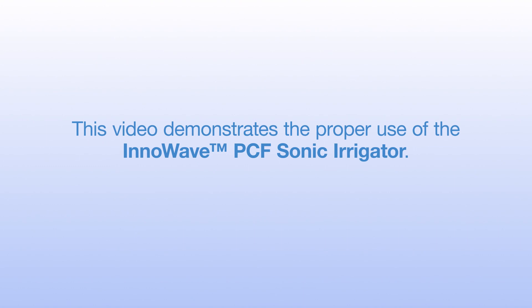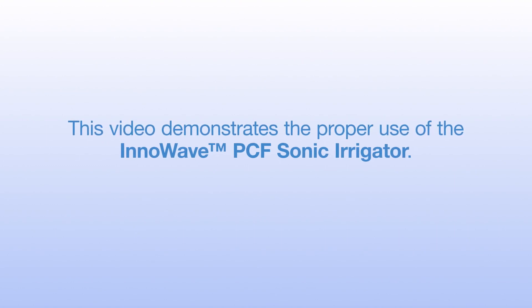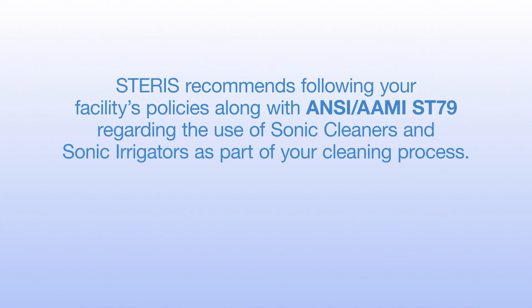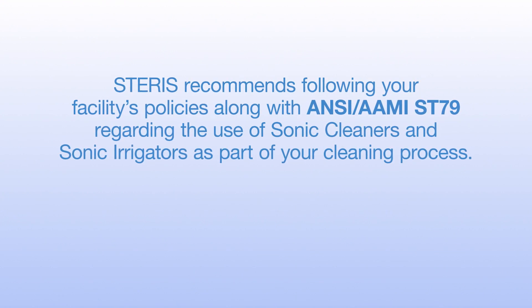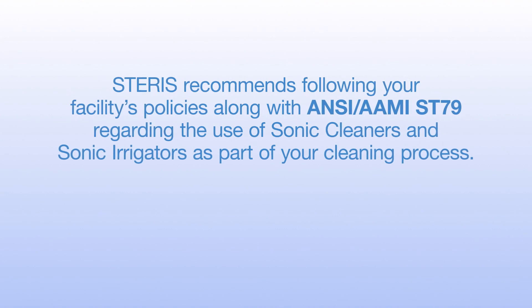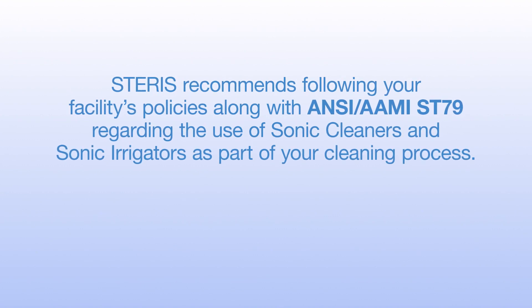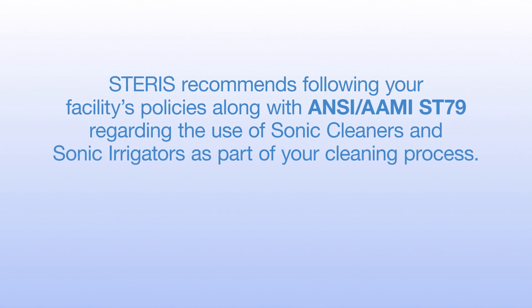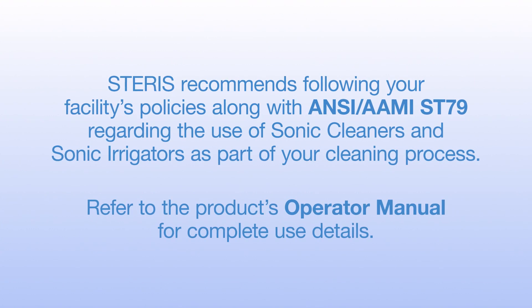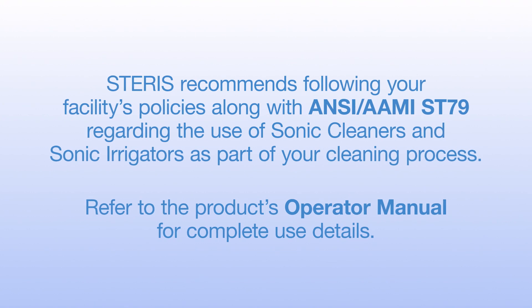This video demonstrates the proper use of the InnoWave PCF Sonic Irrigator. Steris recommends following your facility's policies, along with ANSI/AAMI ST79, regarding the use of ultrasonic cleaners and sonic irrigators as part of your cleaning process. Refer to the product's operator manual for complete use details.